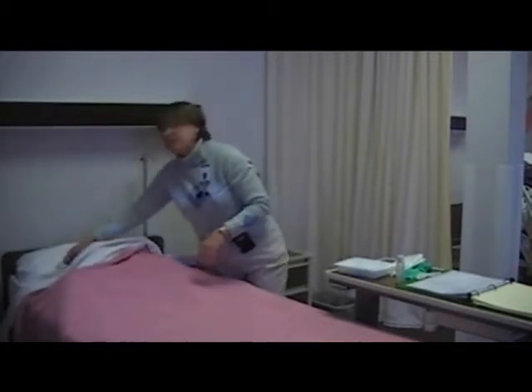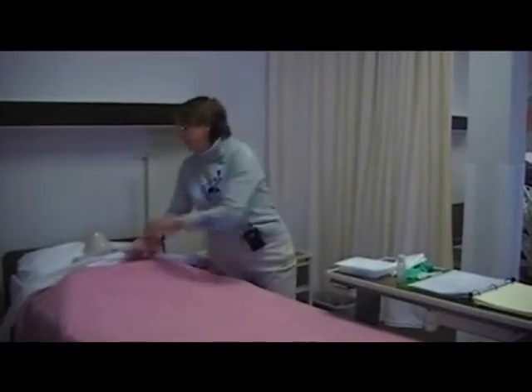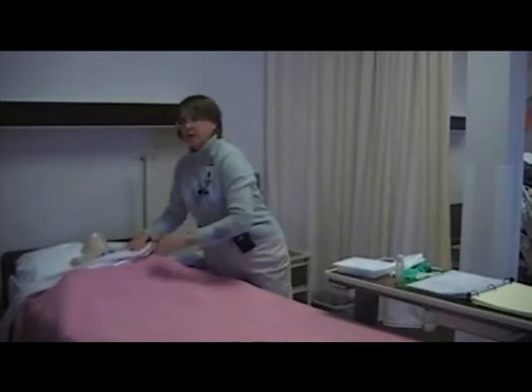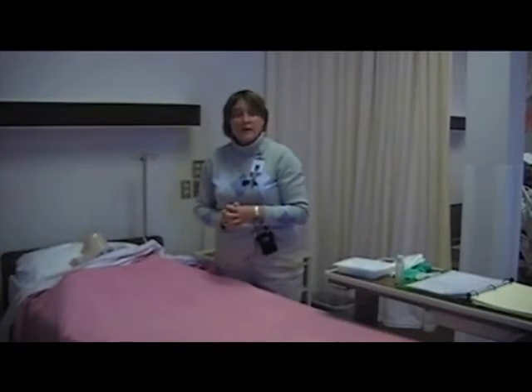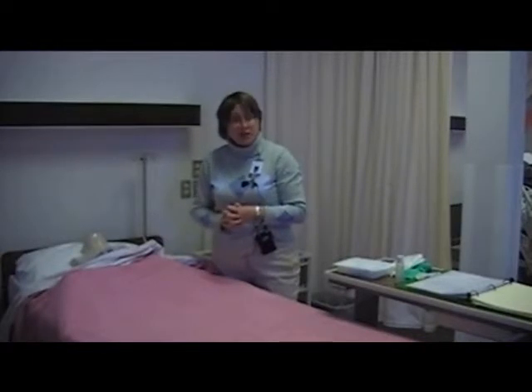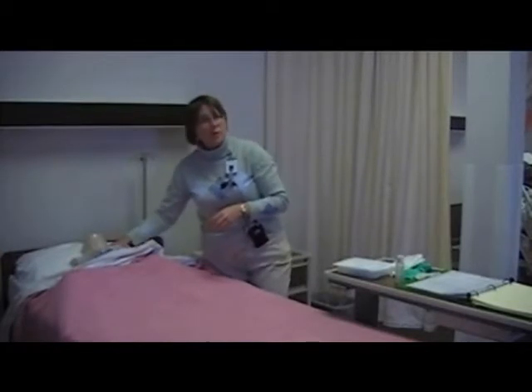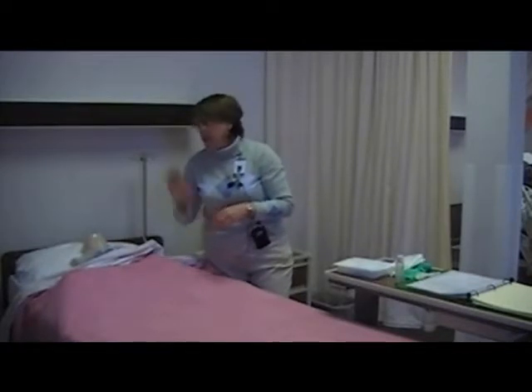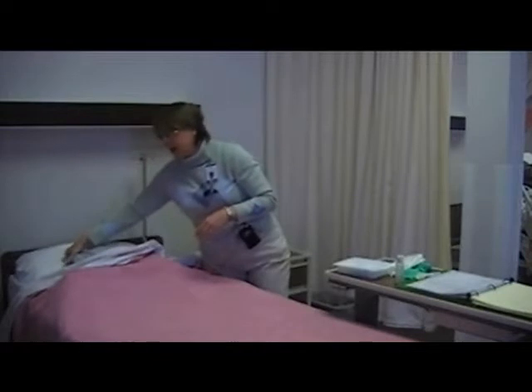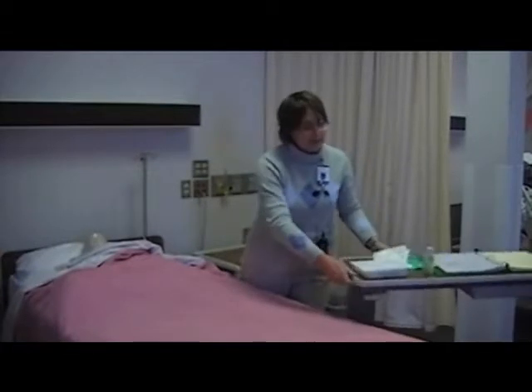So the frequency with which you change these, most often if it's covered by the clear biocclusive film, most facilities it's going to be every 7 days unless the dressing becomes soiled or loose. If it's soiled or loose, you're going to change it then. You're not going to wait until 7 days are up. You've got corners peeling off, you're not just going to try to secure it with more tape. You're going to change that dressing if it's loosening at all. Okay? So I know it's the day for my patient to have his dressing change, and it's going to be a good time now to do his dressing change, so I'm going to go get all my supplies.